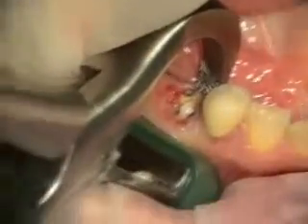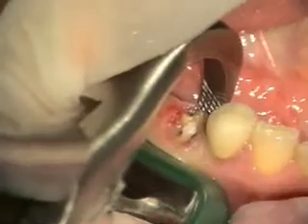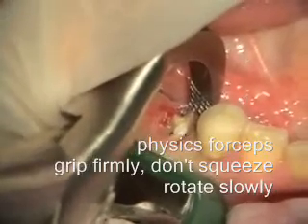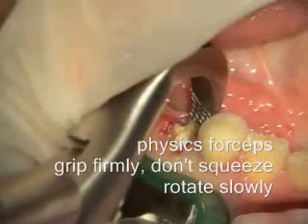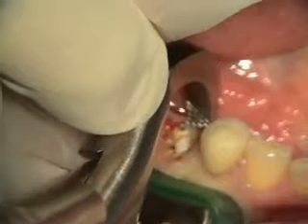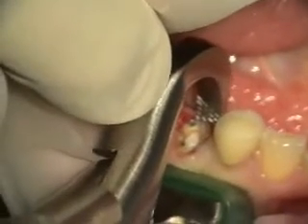So your gum tissue is okay. You can see where that tooth is cracked — it's just totally cracked in half.